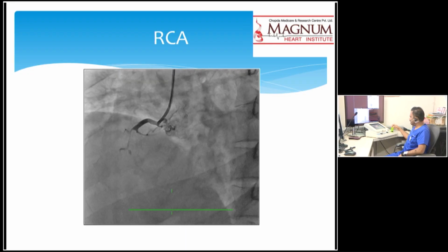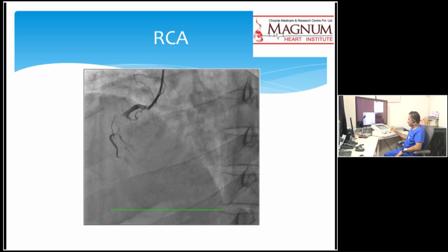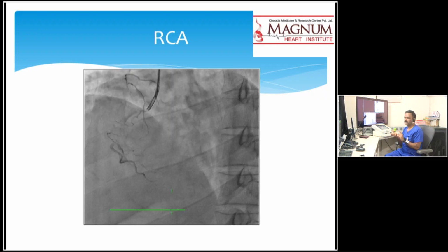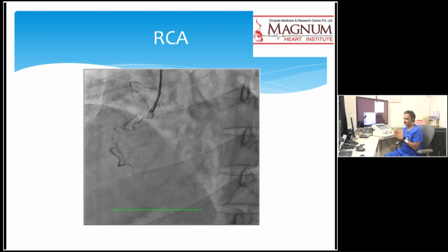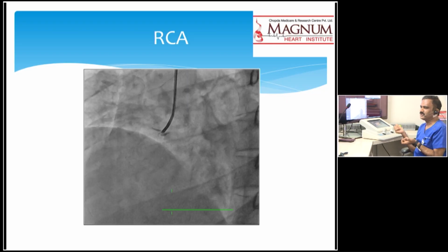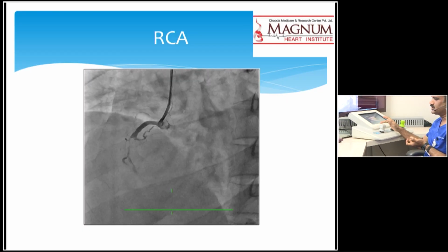This can go antegrade, retrograde, with clockwise and anti-clockwise rotation of the guide catheter, you can see. Then this is the forward movement, antegrade movement, and clockwise and anti-clockwise rotation. And there are 2 to 3 functions for the wire movement, that is rotate and retract. If it goes into some branches, you can rotate and retract, and for the CTO there is a spinning movement and wiggling movement which we do with the hands. The same can be done with robotics, that I will demonstrate during the case. And this is only antegrade and retrograde movement for the balloons and devices.